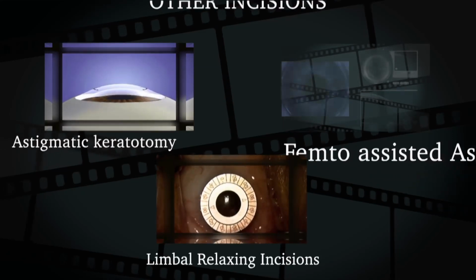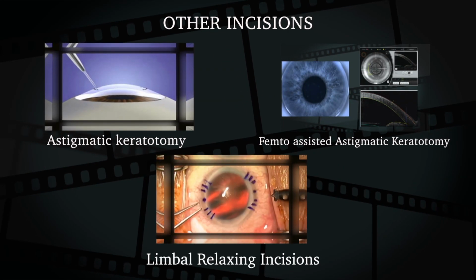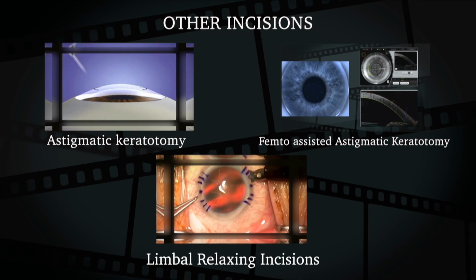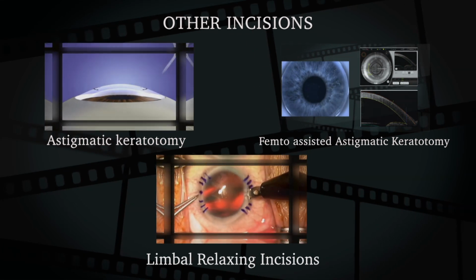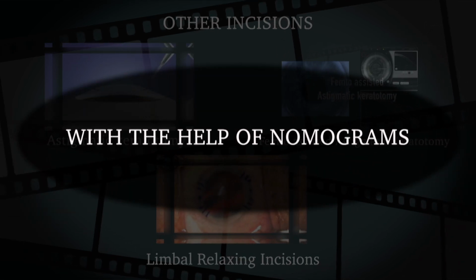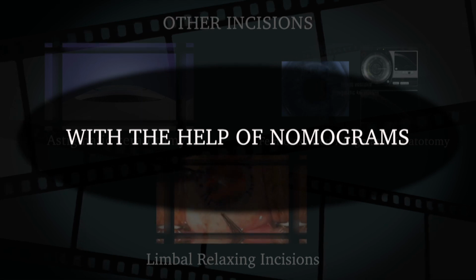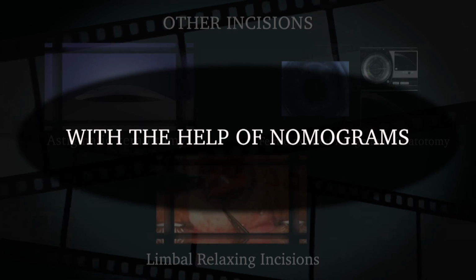We have a number of corneal incision-based options like astigmatic keratotomy, femto-assisted astigmatic keratotomy, limbal relaxing incisions. We can use a number of nomograms which are available online freely and plan the incisions accordingly to manage astigmatism.